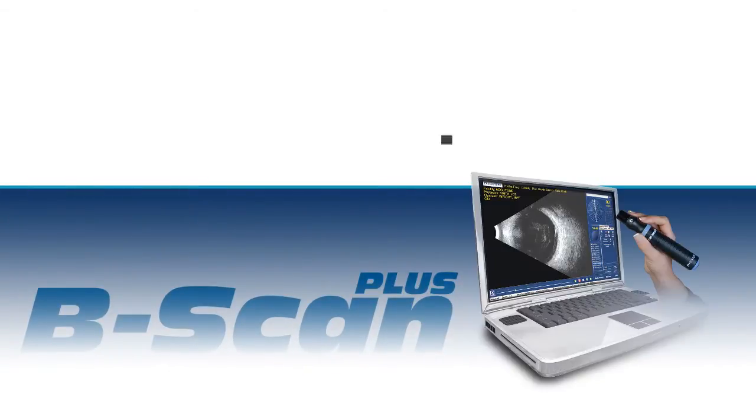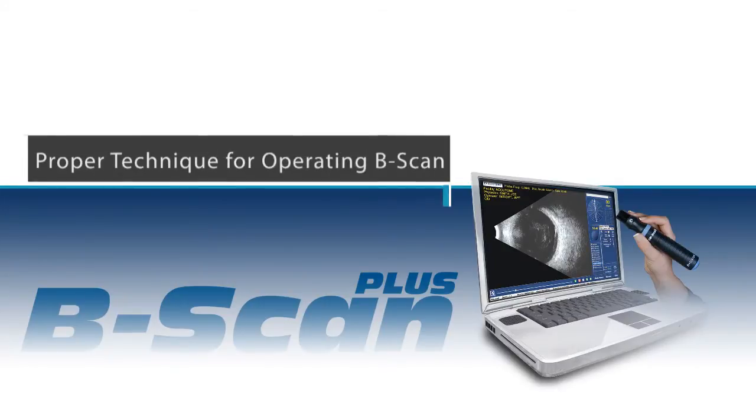Today we are going to outline the proper technique for operating the Accutome B-Scan.